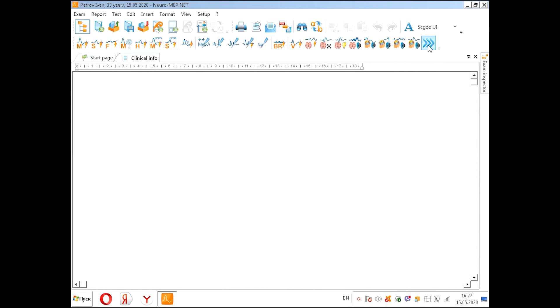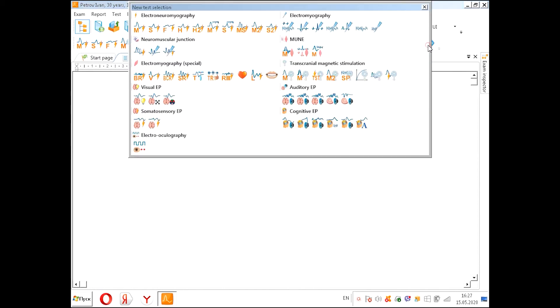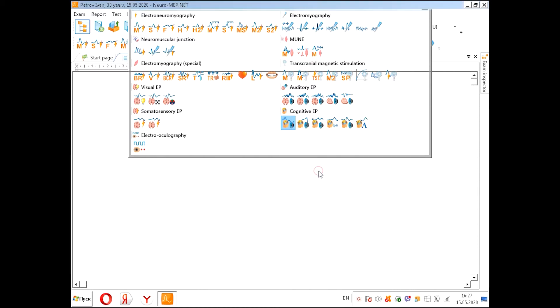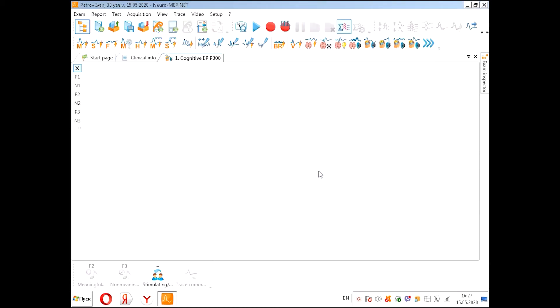Now we need to look for our test, the cognitive P300. We need to choose the two channels one first time, and we are going to the window of this test.